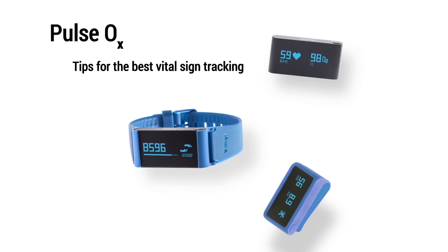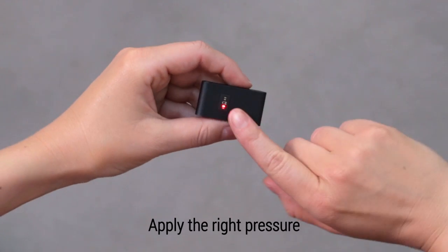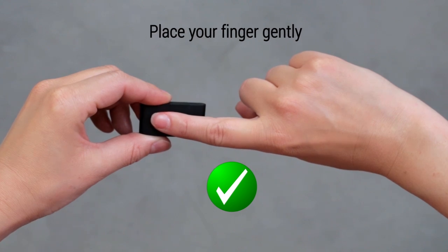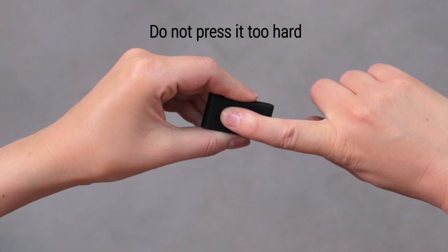Tips for the best vital sign tracking with the Pulse OX. The first thing to know is to place your finger gently on the back of the device, and to be careful not to press it too hard as it might disturb your blood flow.